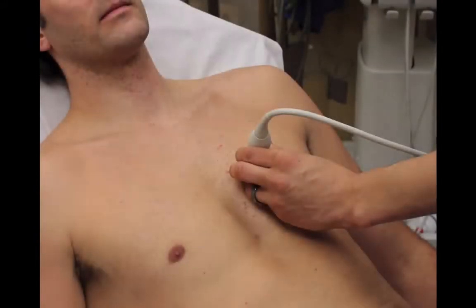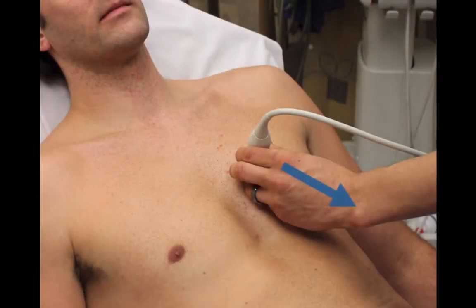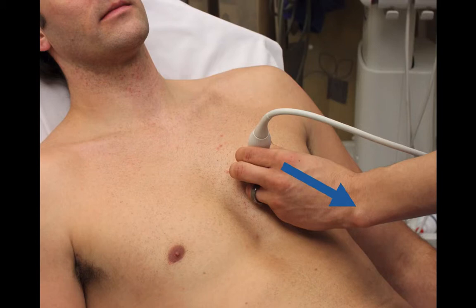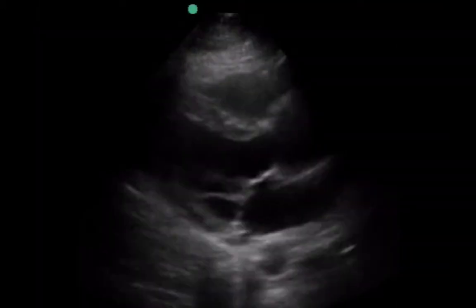We're going to start with a parasternal long axis approach first. With the way that most ED ultrasound machines are formatted, the probe marker is going to go down to the left hip. And this is the image that you're going to look for.